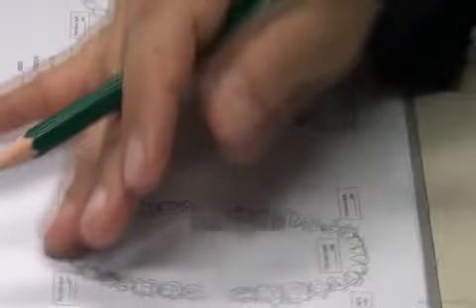Suppose this is a free end saddle, and this is the abutment. Sometimes the undercut is not where I like. Where do I like undercuts in the abutment of a free end saddle?